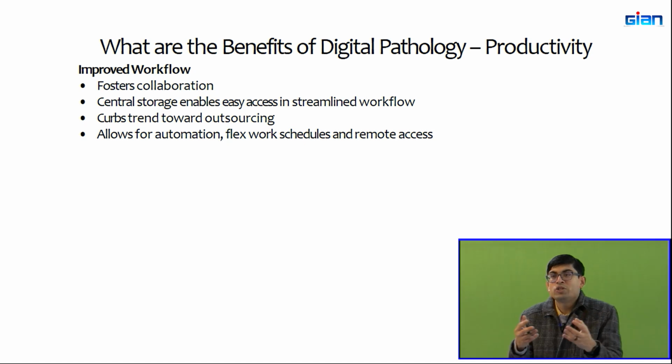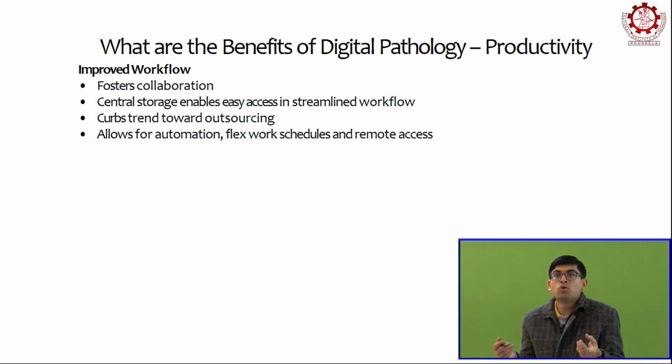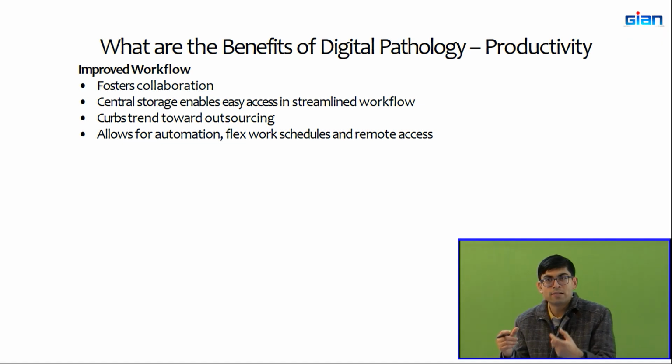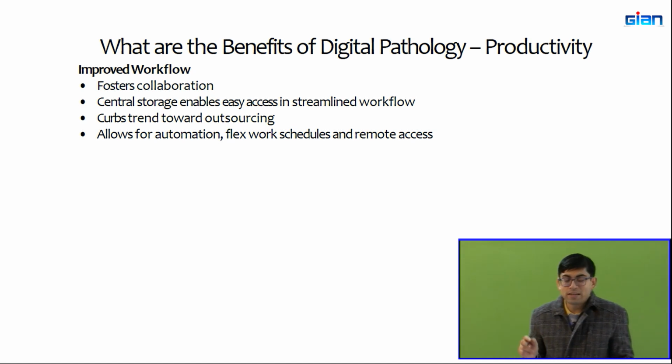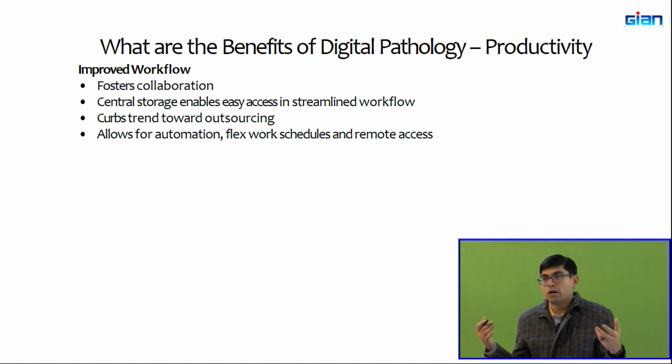So how do we share the slides? You can't expect to give this slide to a biomedical researcher. They look at it under the microscope, and there's not much that they can do. Maybe they can do some qualitative analysis, but there's not much you can do beyond that by looking at the slides under a microscope. But if the slides are digitized, you can share them with other people. We routinely have collaborators sharing slides with us. So we can take these images, look at them in multiple different ways, and then apply our deep learning techniques and handcrafted feature analysis, and get information which otherwise would be impossible.